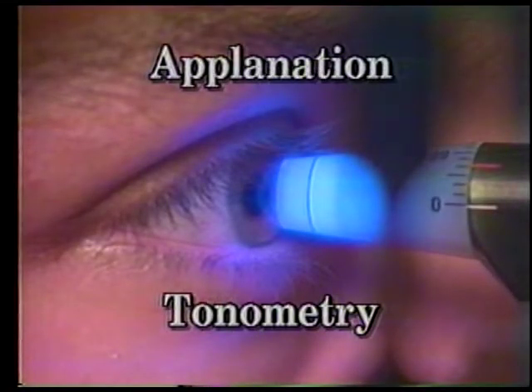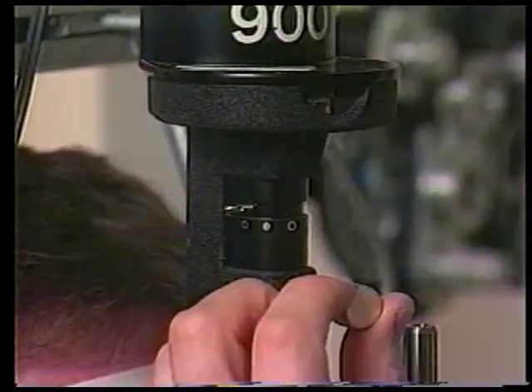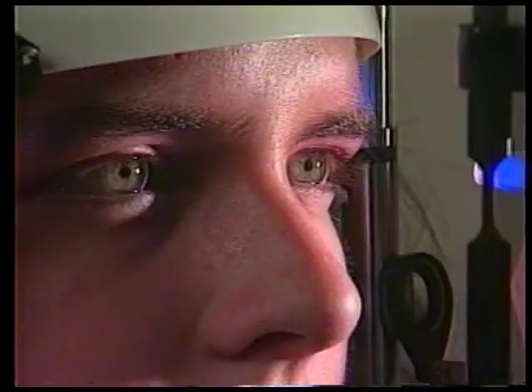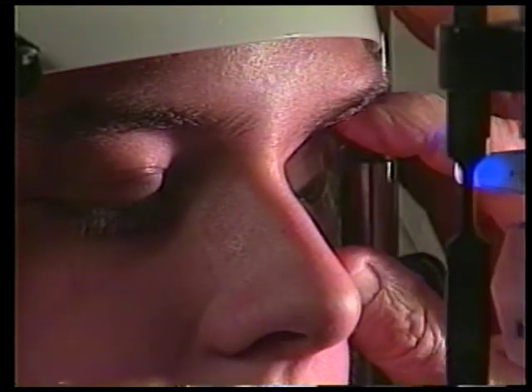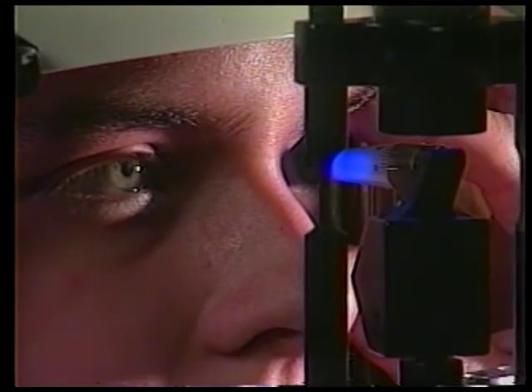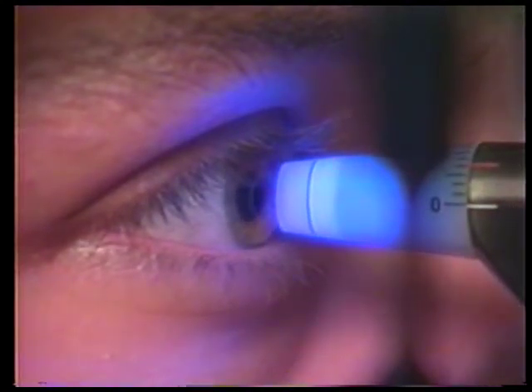Applanation tonometry should be performed after the anterior segment examination. Place the tonometer in position. Insert the blue filter in the slit beam path. Anesthetize the eyes and instill fluorescein. Then gently move the slit lamp carriage with both hands towards the eye. If the patient withdraws, have them look down and gently lift their eyelid and hold it against the brow. Guide the tonometer and slit lamp carriage with your free hand to almost touch the eye. At this point, have the patient look up at an appropriate target such as your ear as you advance the tonometer prism onto their eye. If the patient is not intimidated by the advancing tonometer tip, you can eliminate holding their upper eyelid.